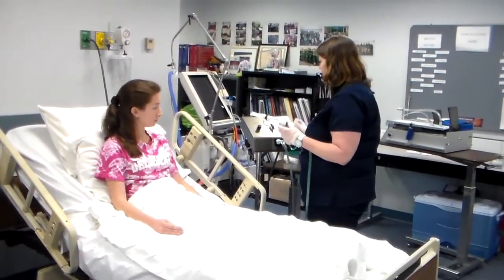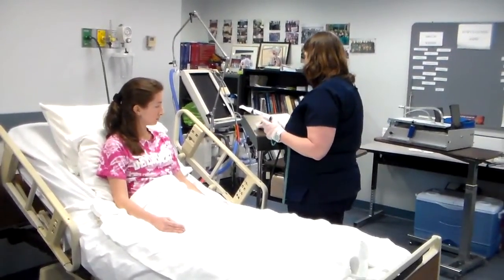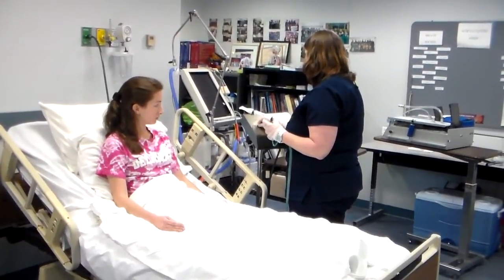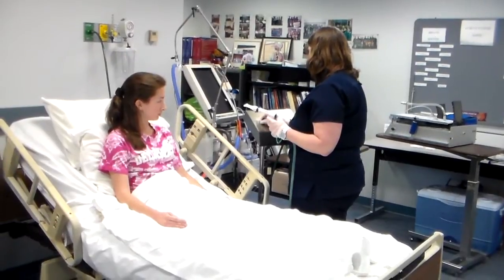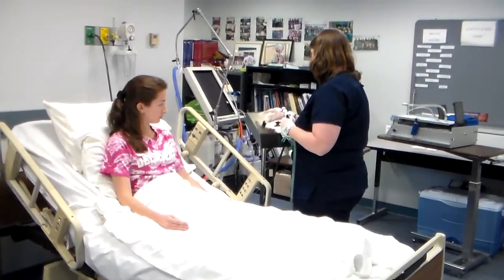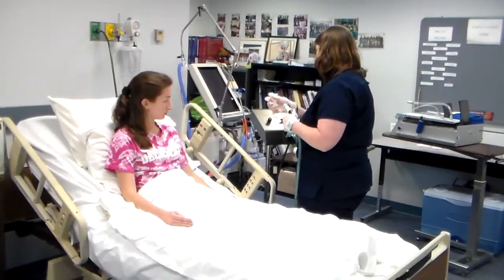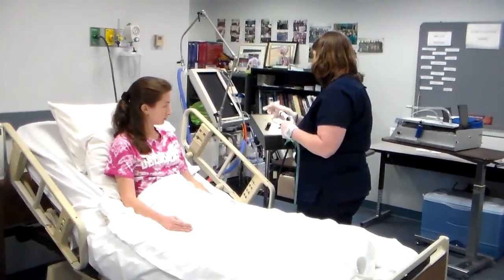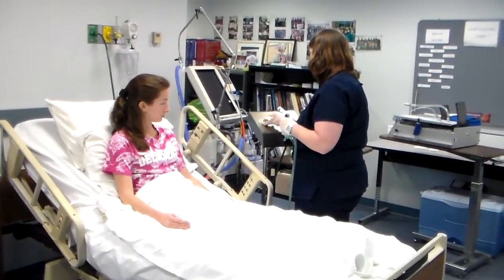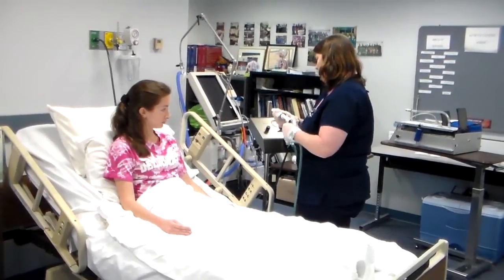Turn on the Metaneb and adjust the dial to CPEP. Occlude the patient port and adjust the CPEP flow level until the manometer reads 10 centimeters of water pressure. The patient should be able to achieve the 10 centimeters on each exhalation. If this is not achieved, the flow must be manipulated until the 10 centimeters of water pressure can be attained for maximum therapeutic effect.